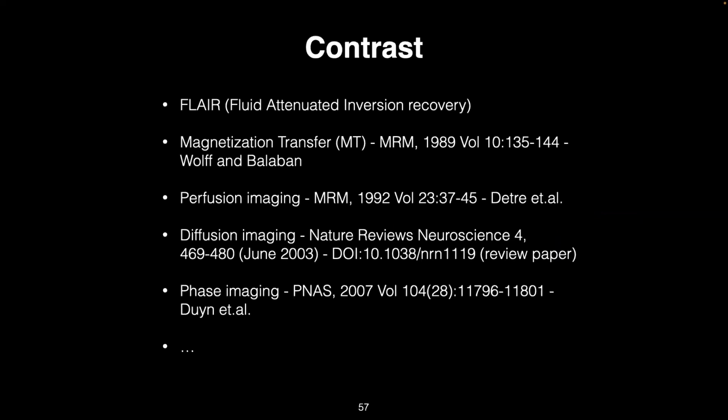All right, so these are just a few of the common basic types of contrast that we look at most frequently for the types of experiments that we support and that most of our researchers are interested in. But it is by no means the end of what is possible with MR. In case this hasn't been apparent, it is very sensitive to timing and what you do with your gradients and how you play your RF and the relative timing of those to each other.